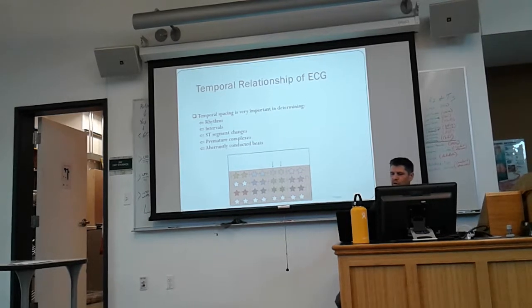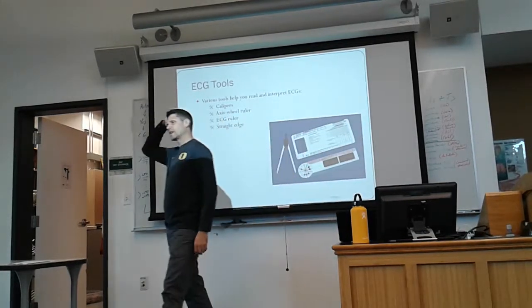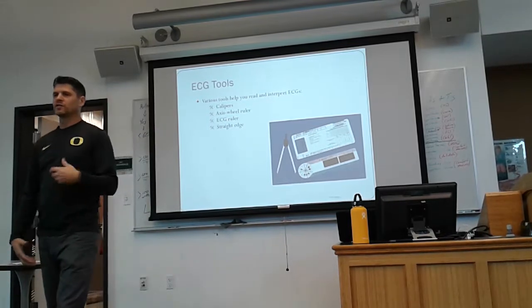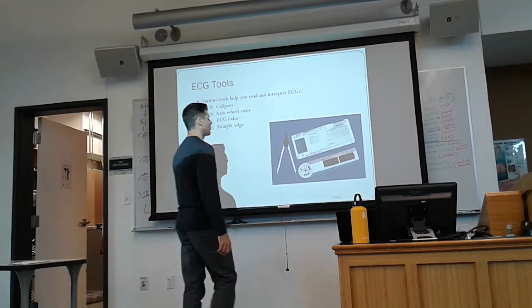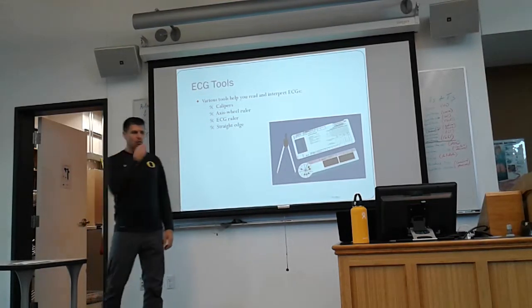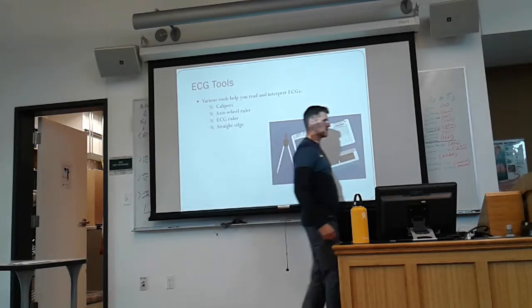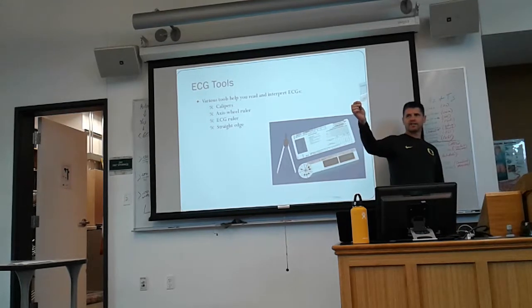Okay, in terms of tools, there's a variety of different tools that you can use to measure EKG. You're going to be allowed to use two of them in this class. One will be calipers, so you should start bringing calipers to class all the time now. And one will be the ruler that I gave you, the straight edge that I gave you.